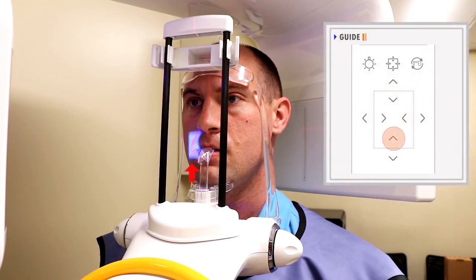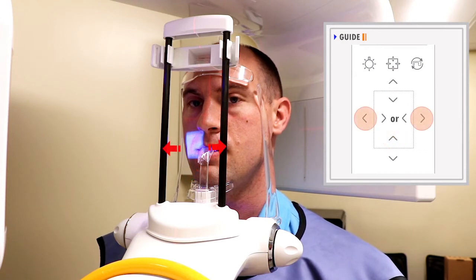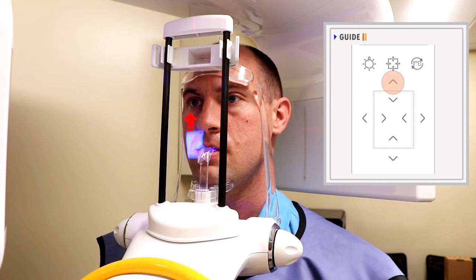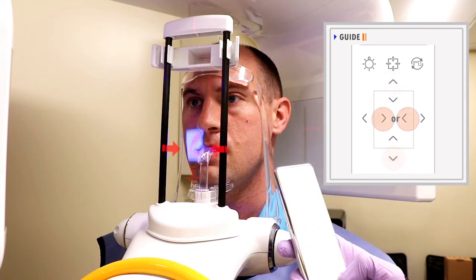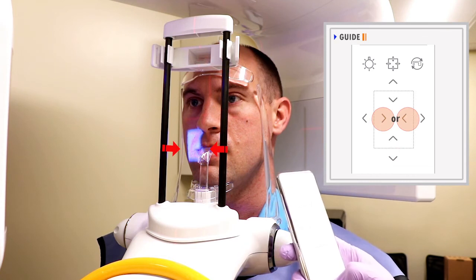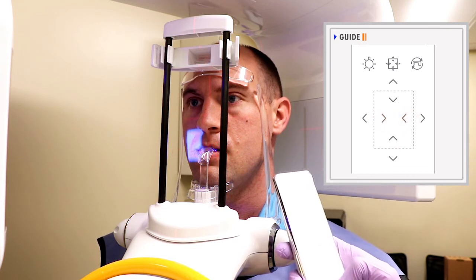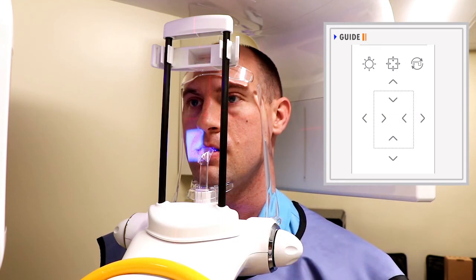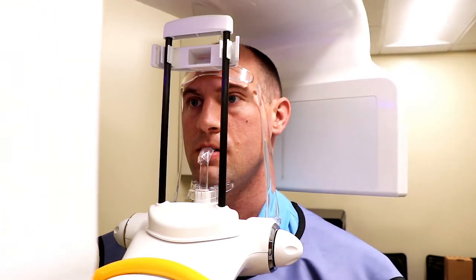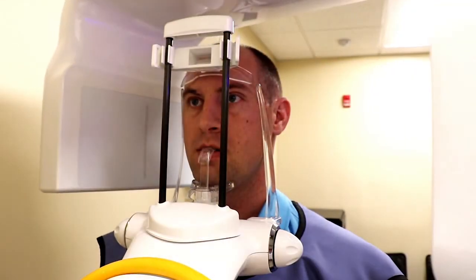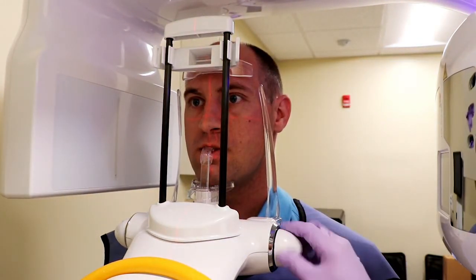You can adjust the FOV size using the keypad on the remote controller, as shown on the screen. Tighten the temple supports.